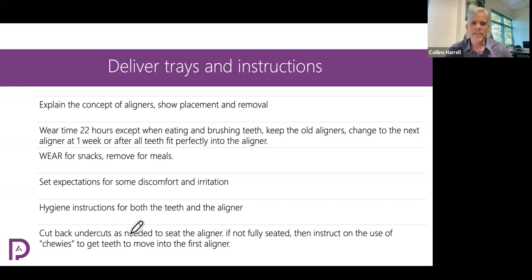Okay, and we'll talk more about this. I know I'm going through things fairly fast, and I can't teach you the whole entire aligner education in the 2 hours that we have, 2.5 hours that we have together. So I know we're going fairly quick through this, but we just at least want to touch on these things briefly, okay? When you go to deliver the aligner the first time, you may need to cut back any undercuts.